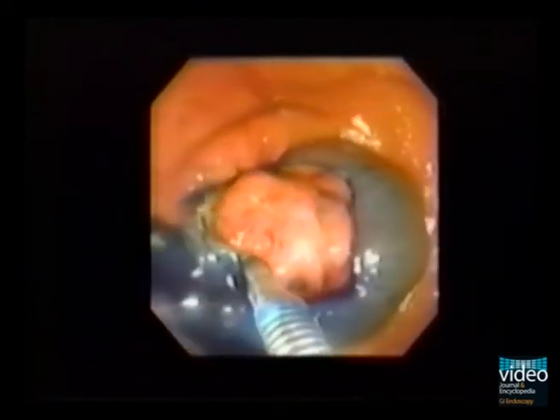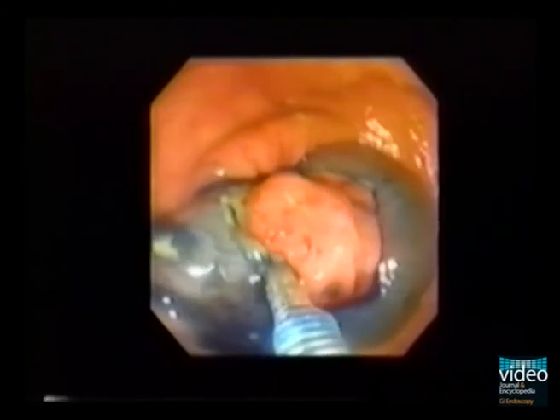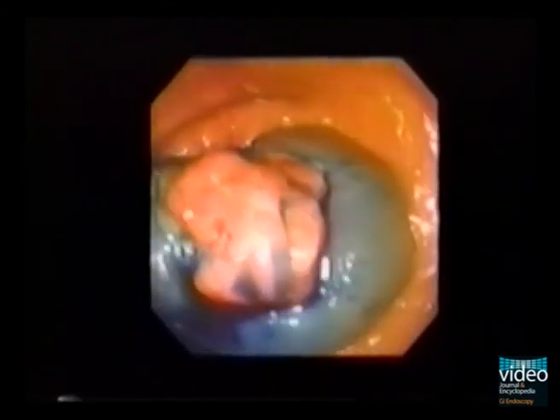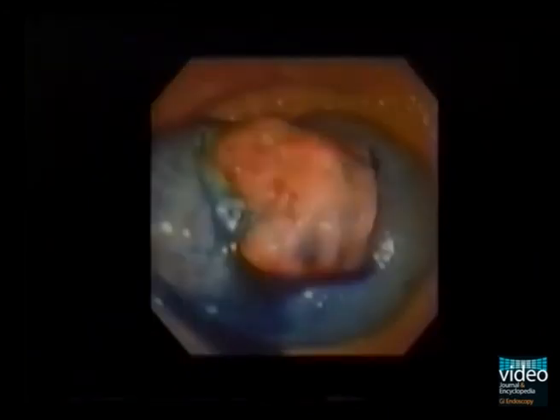Indeed, the maximum invasion depth was the muscularis propria, corresponding to a T2 carcinoma.